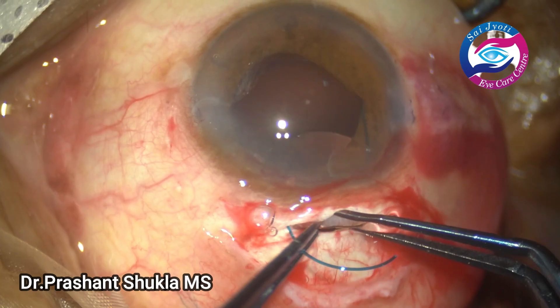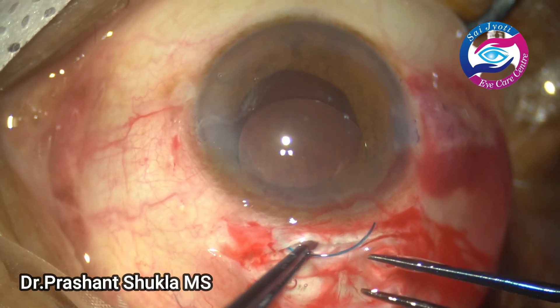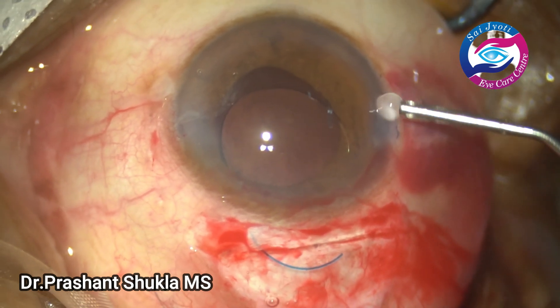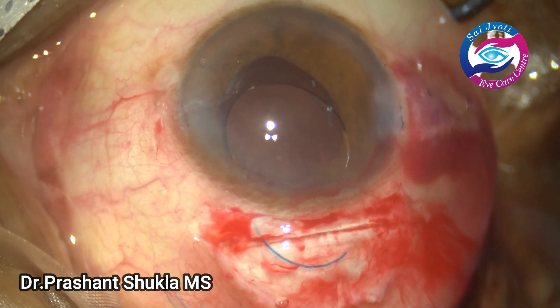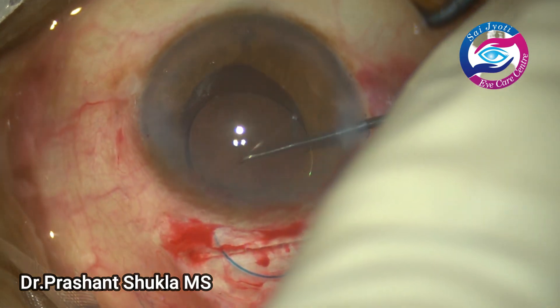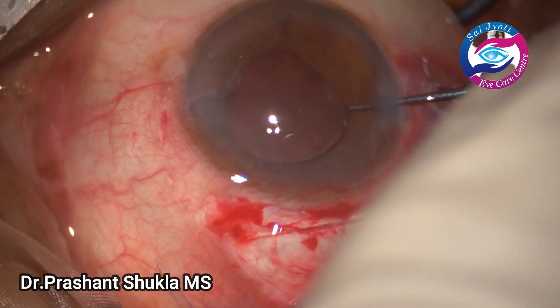One haptic goes directly into the capsular bag. The lens is gently lifted and then the haptic is placed into the capsular bag. Some more viscoelastic is instilled. Now using a Sinskey hook, the optic-haptic junction is gradually held and the other haptic is also dialed into the capsular bag.